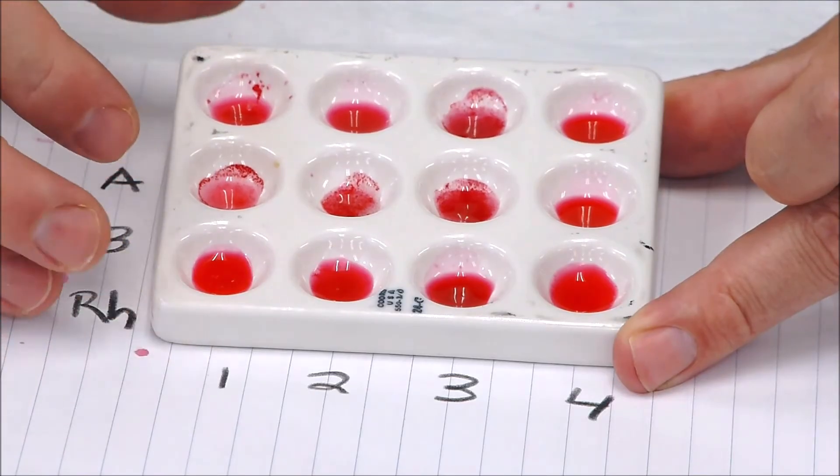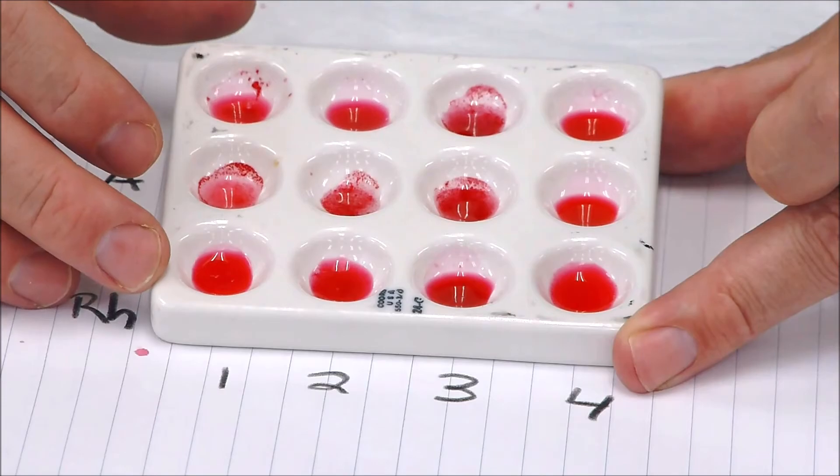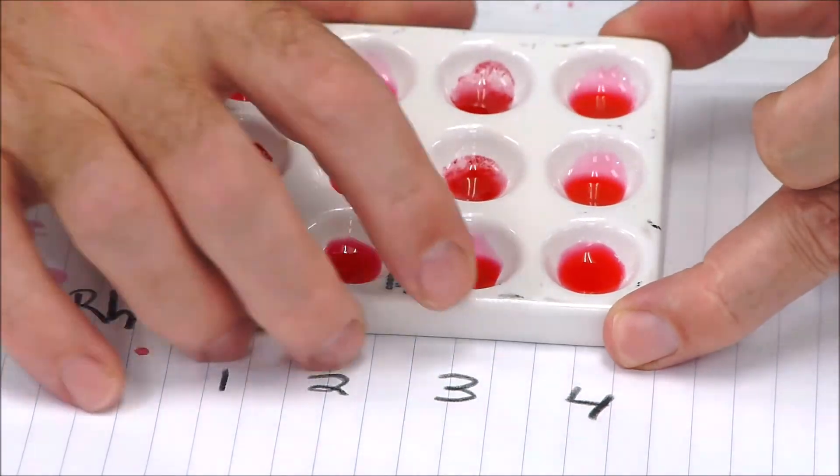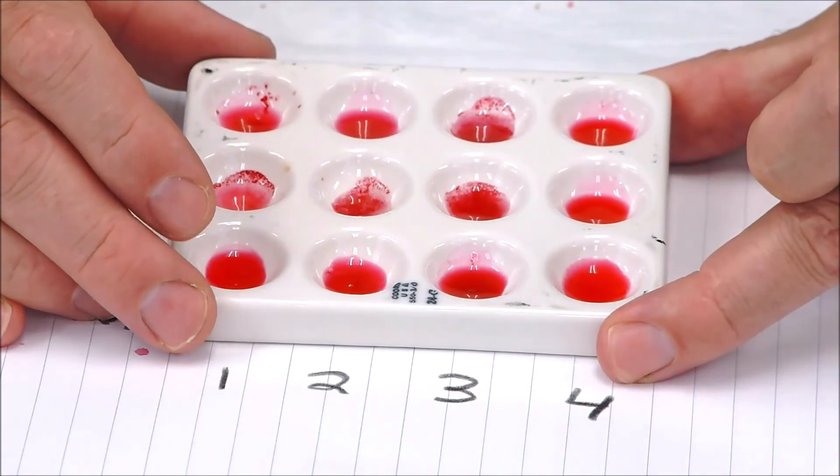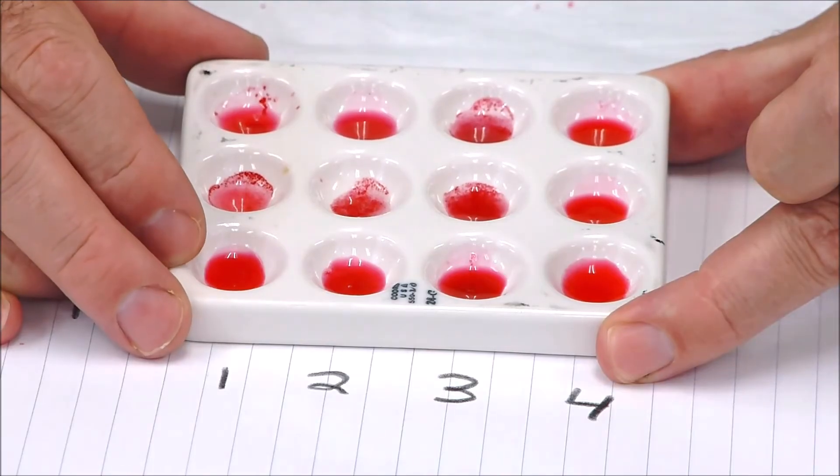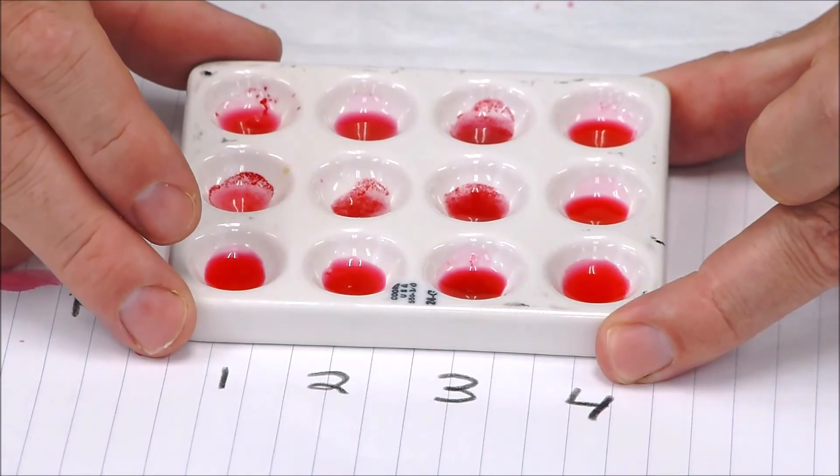Well, as it turns out, this fake Rh antigen doesn't work very well and it's kind of gelled uniformly across except for in the third well. So we'll just call anything that gels positive, okay? So if we have B and we have gelling down here on Rh—it would normally be agglutination—we would call that B positive blood.